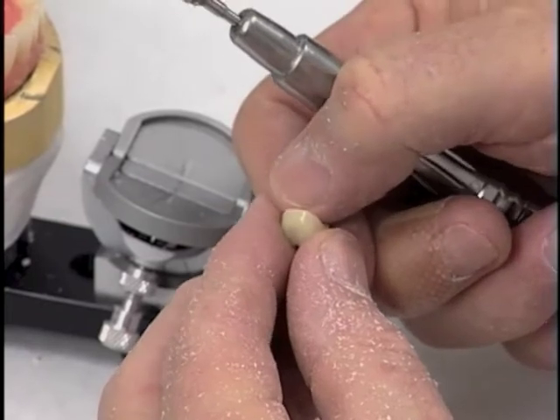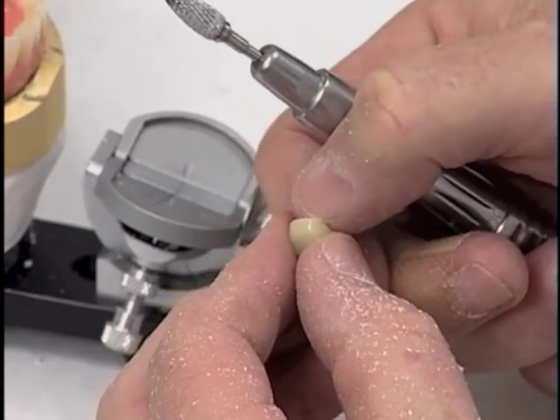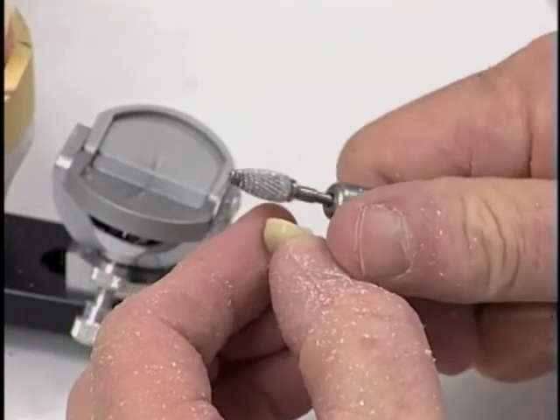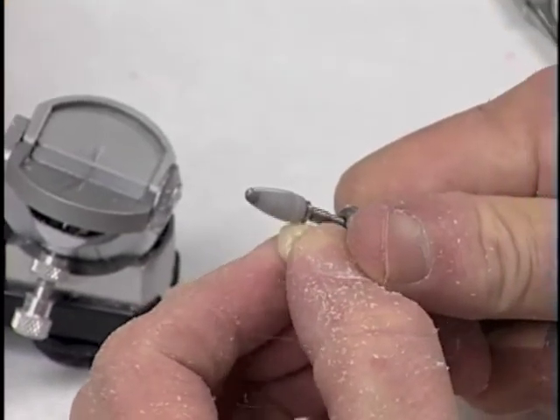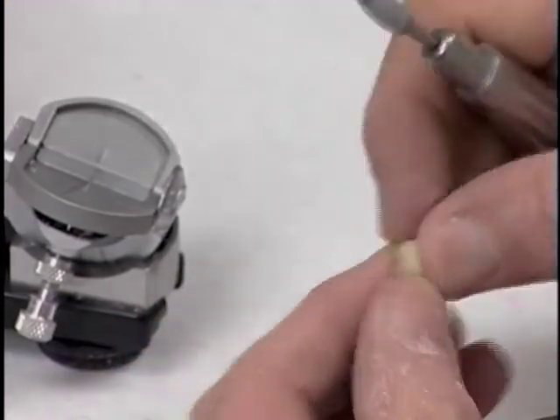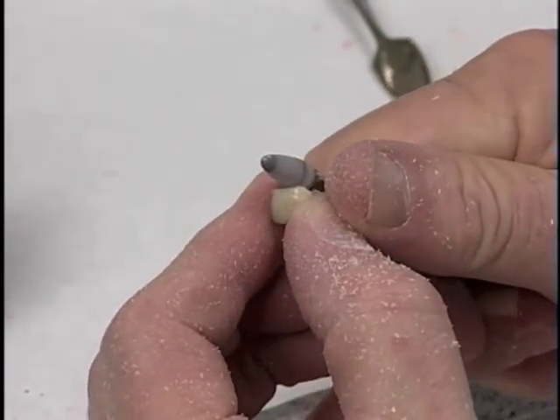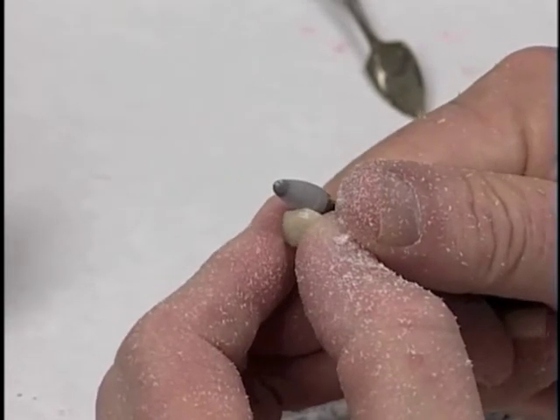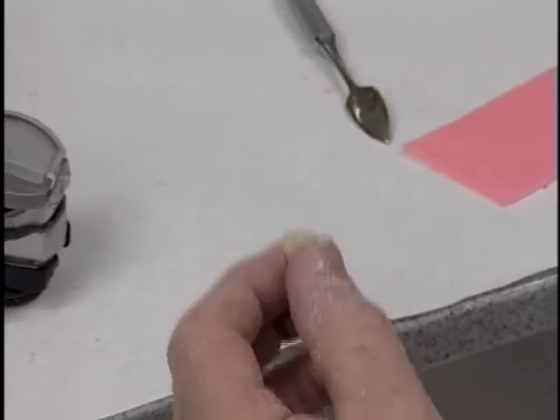As we could see where the interference was in the wax, it was the collar of the tooth, which is right along here. Okay, and we can see the collar of the tooth, so there's a little excessive material there that would not allow us to set that tooth all the way, so we're just going to trim the collar of that tooth down enough so that tooth should go back in place.